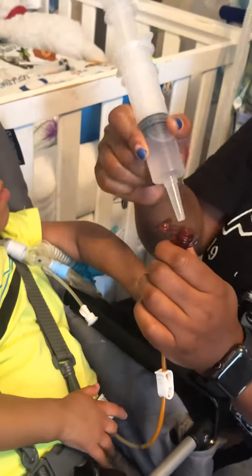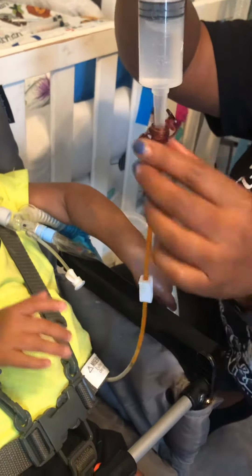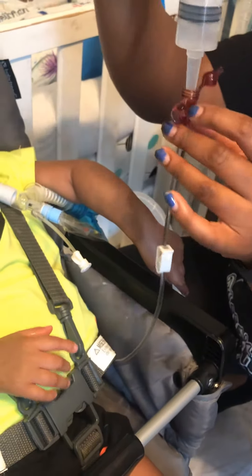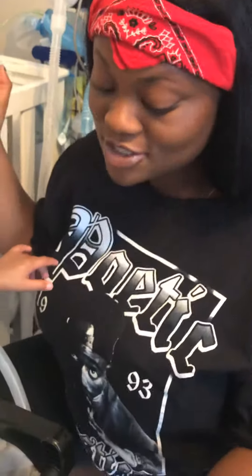Then you flush — using the big port — with the water syringe. You unclasp it and flush. I gave him about 20 ml of water. Then you close the clasp, close the top of the port, and that's how you give meds through a G-tube.